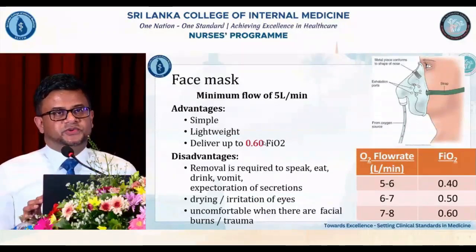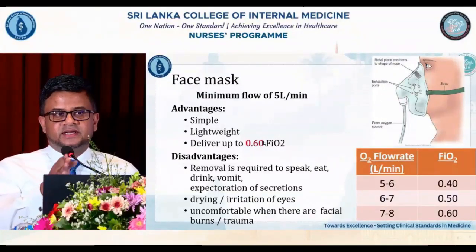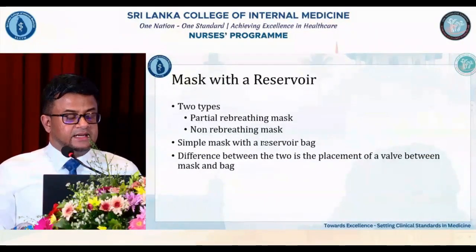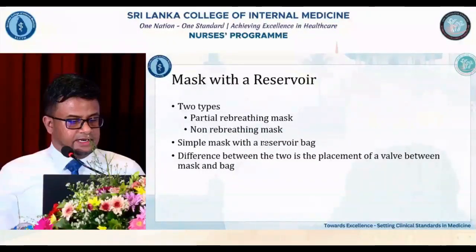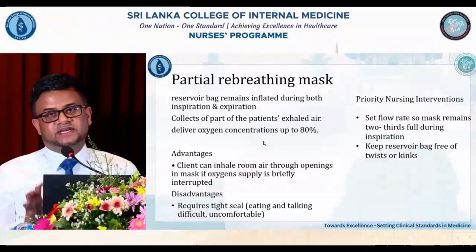Make sure you document these things when you are using a face mask. What is the flow rate that you are using? What is the amount of oxygen that you are using? And when it comes to masks with reservoir, there are 2 types. The reservoir bag remains inflated during both inspiration and expiration.